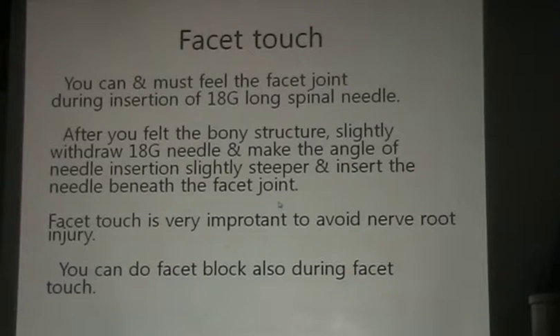So the basic and essential point is facet touch. You can and must feel the facet joint during insertion of an 18 gauge long spinal needle. And after you feel the bony structure slide, withdraw and make an angle of the needle, and insert the needle beneath the facet joint.